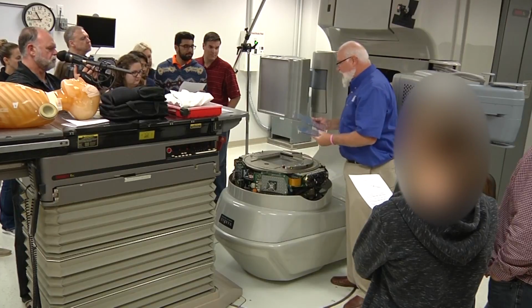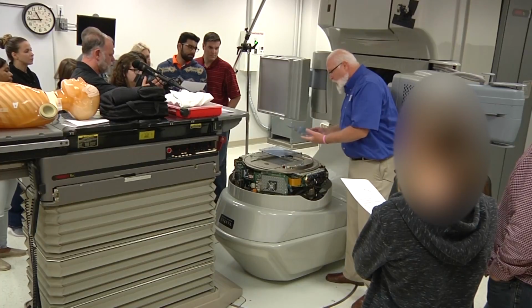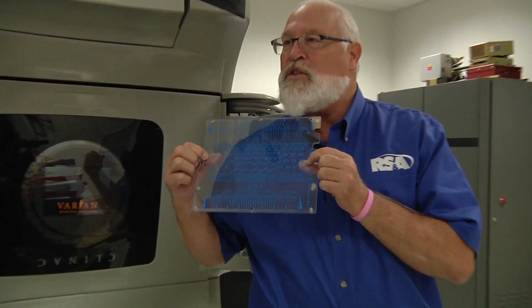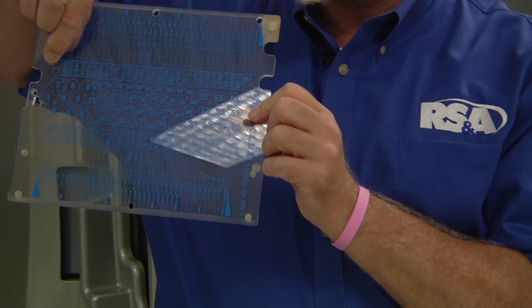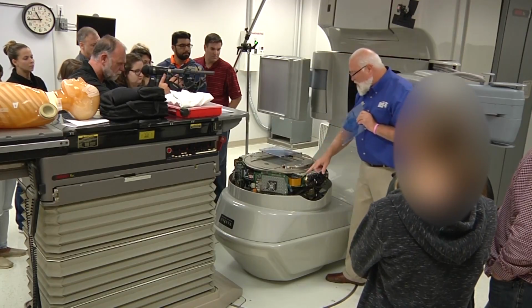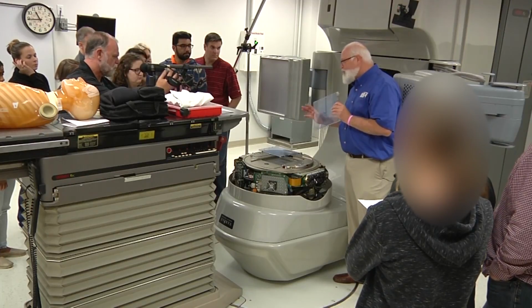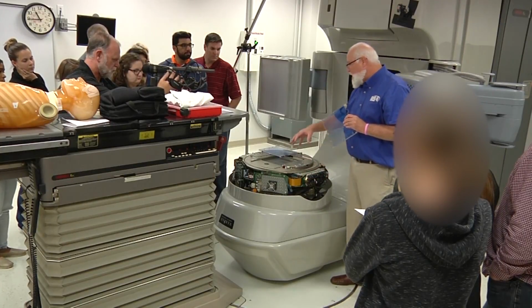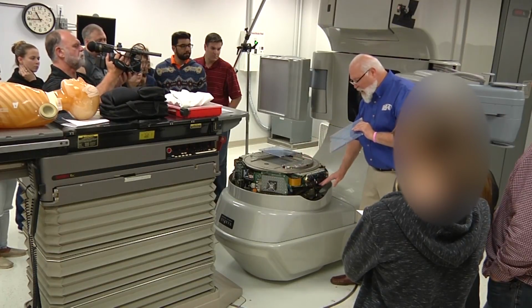So Varian made life easier for us. They call these clues. What it does is it tells you the location of the motor per leaf. And then it also shows you where the connector is for that motor to drive each one. So it doesn't just go 1, 2, 3, 4, 5 across. It's kind of mangled slightly, but usually all the ones on the top are going to be for your top motors, your even, and most of the ones on the bottom are going to be for odd.